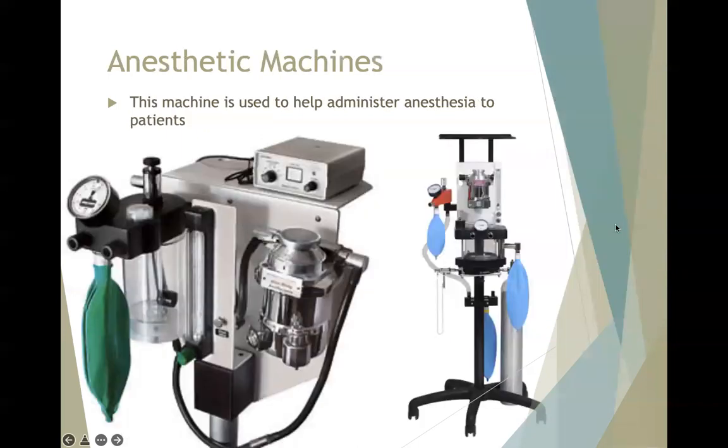All right, we're almost finished here, you guys, just a few more slides. So with our anesthetic machines shown here, we did go over that in our chapter 9 lecture. So looking at our vaporizer, we have the bags here, our reservoir bags, depending on the size of our patient. And we'll be connecting whether we're using a rebreather or a non-rebreathing system. And we do know that these vaporizers are going to be labeled with whether we're using isoflurane or sevoflurane.